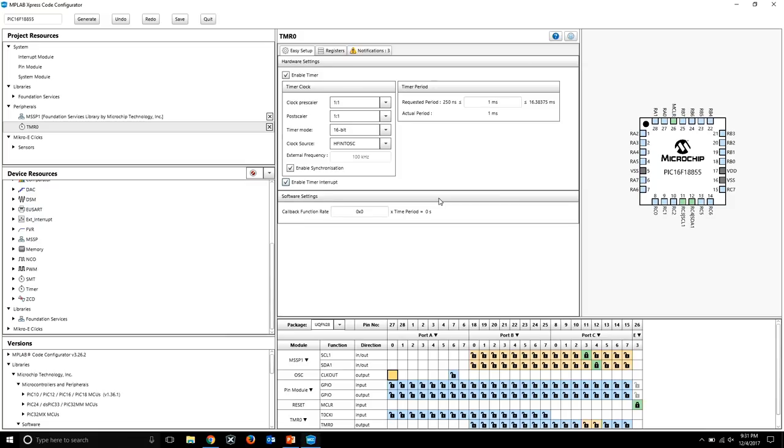That's how you initiate a timer interrupt, timer 0 would interrupt. Will it give you an error in case something like that happens, or will it notify you when you get the data? That's correct. It will actually not tell you what's wrong, because as an MCU, it does not know what you're trying to program. But once you compile, to use that example, it will give you an error, and you will eventually see the error and know.